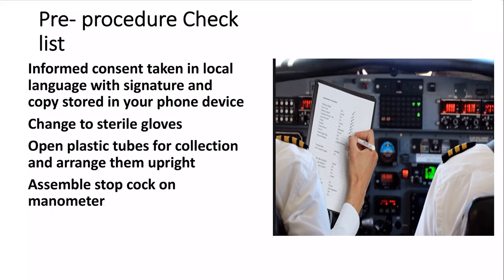Now in our case, we did not have access to a manometer, so we have not demonstrated that, but yes, once available, the opening pressure should definitely be checked. Draw the lignocaine in a 10 ml syringe, because most of the standard kits would have a 3 ml syringe, but you might require a much higher amount of lignocaine in some patients. It's always a good idea to achieve a good amount of local anesthesia, because lots of times you might have to withdraw the needle a bit and then push it a little more, and therefore it can cause a substantial amount of discomfort in the patient.